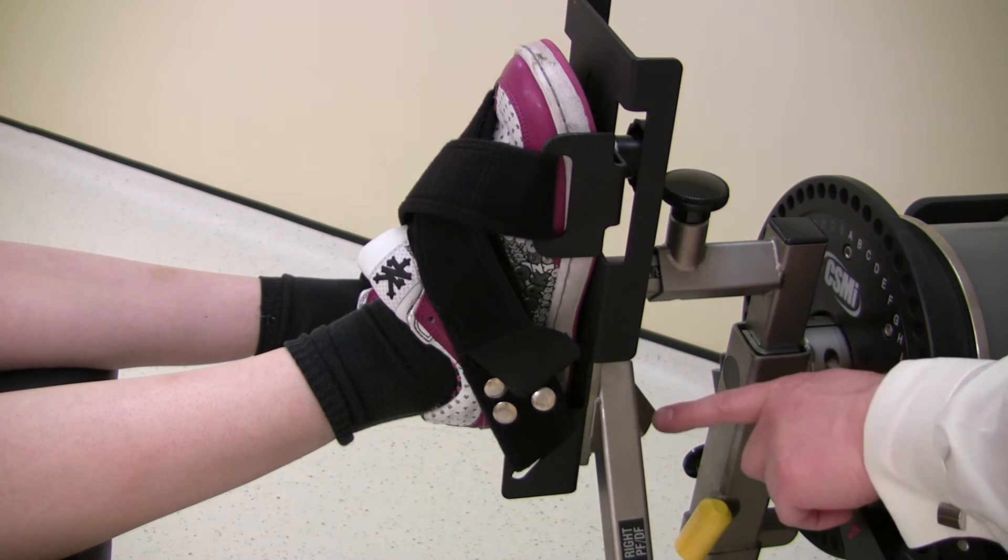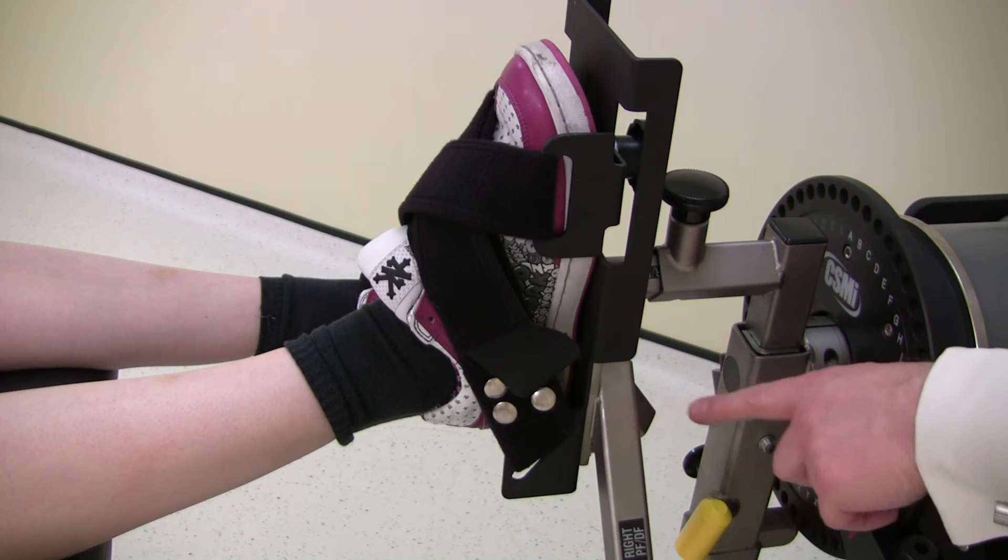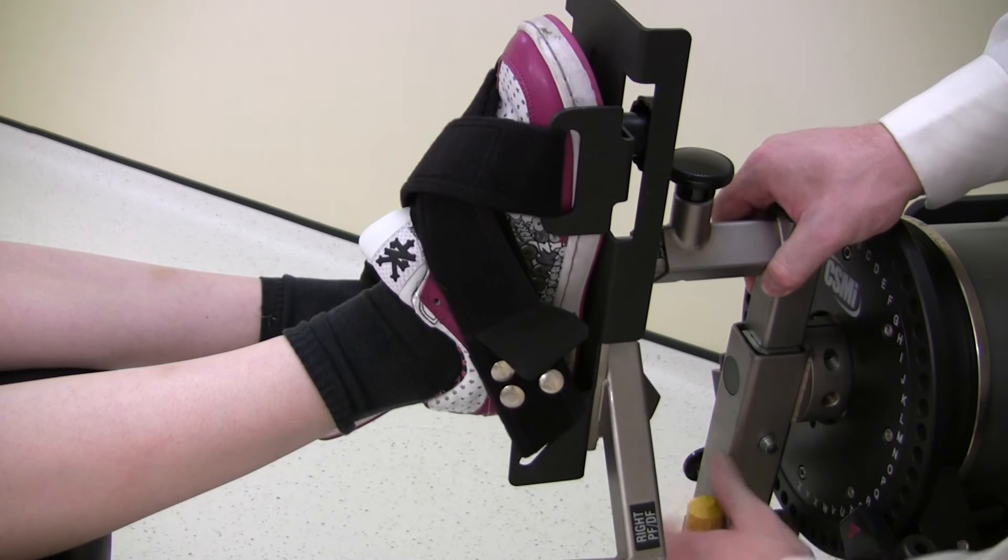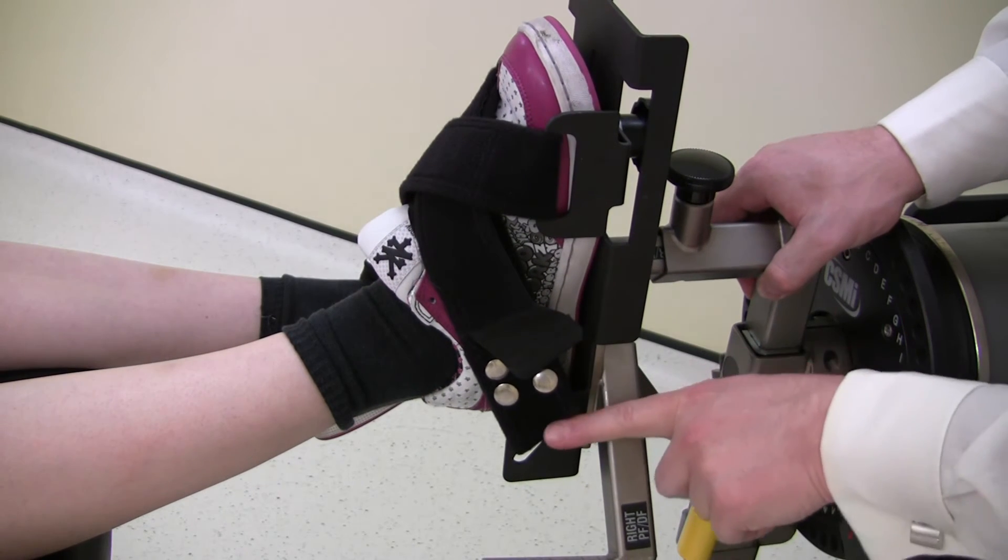The axis of rotation is set once the heel of the foot is opposite the black dot on the dynamometer input arm. Adjust by loosening the ankle adapter and extending or shortening the tube.